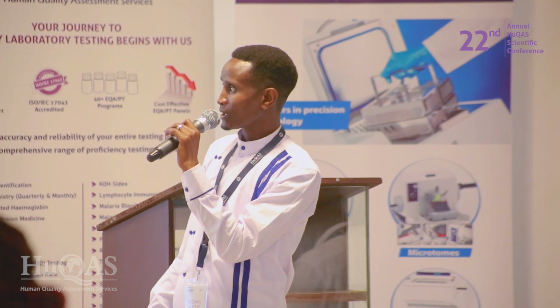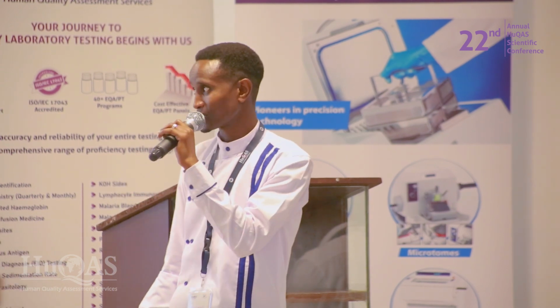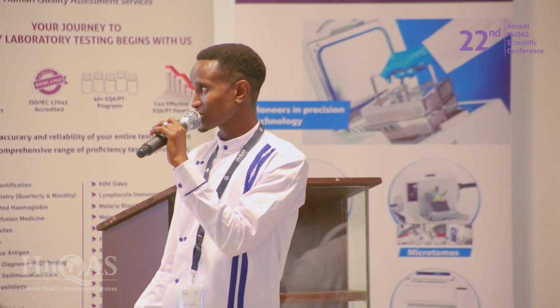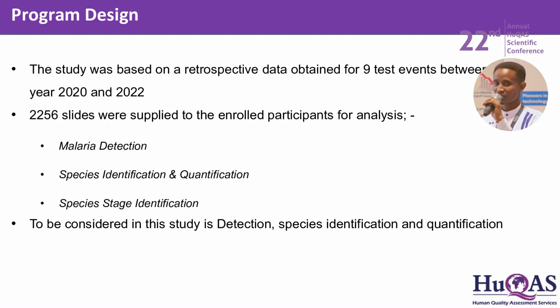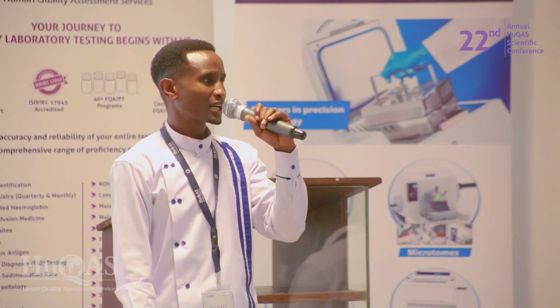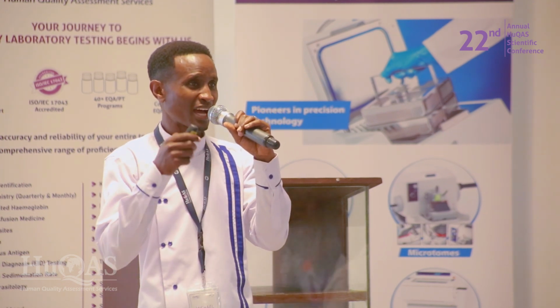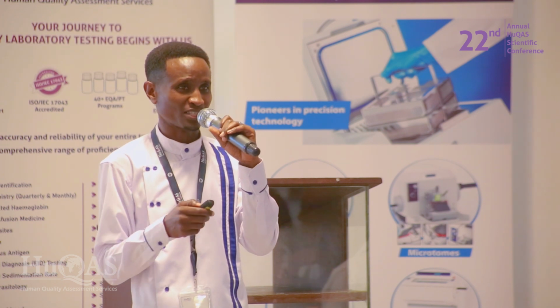So in the study, we had the microscopists do 2,256 slides, where they were supposed to do malaria detection, species identification, quantification, and species stage identification, which I'll shelve a bit for now. What do we mean when we talk about detection? Yes, detection has two aspects. Mostly you find that WHO will talk about only giving you the malaria positive slide, so you're able to pick it as positive. They expect you to pick it as positive, yes, having malaria.